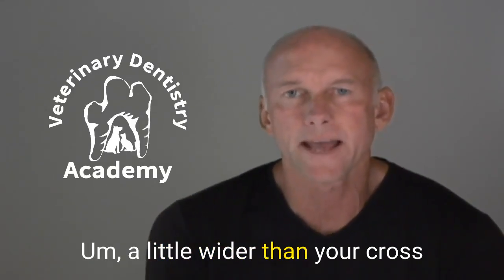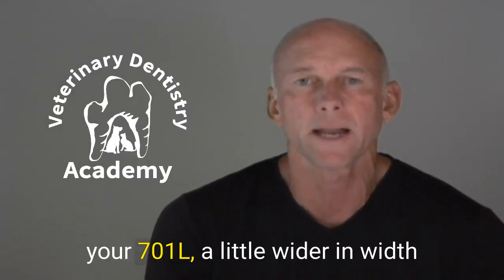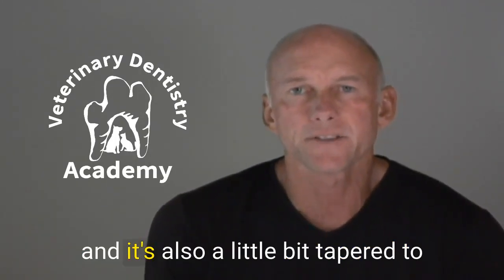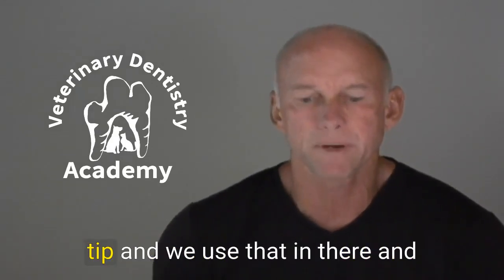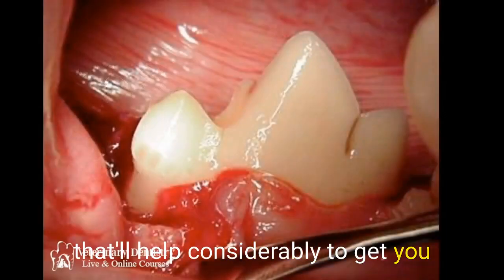The cylindrical diamond is a little wider than your crosscut tapered fissure burr — the 701L — a little wider in width, and it's also slightly tapered to the tip. There's a slight taper from the base to the tip, and we use that in there, which helps considerably to get that area really well cleaned out.